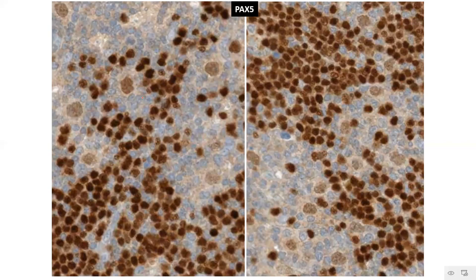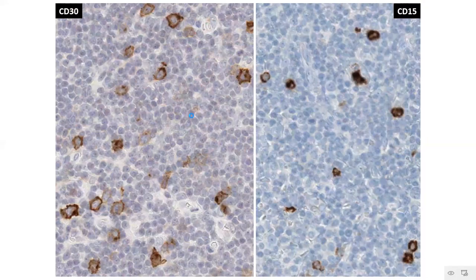PAX5 again fits into the characteristic description of what we have already talked about in the context of the Hodgkin Reed Sternberg cells. That is, you see a dim expression within this atypical large cell population when you compare them to the background small B lymphoid cells. Right, so that's one point in favor of classic Hodgkin lymphoma.